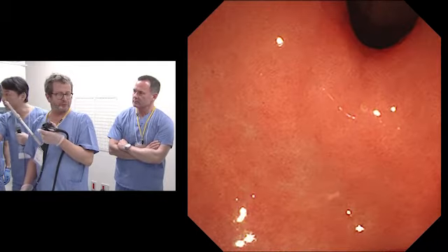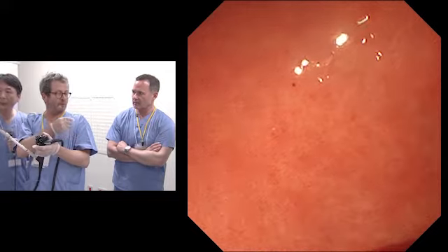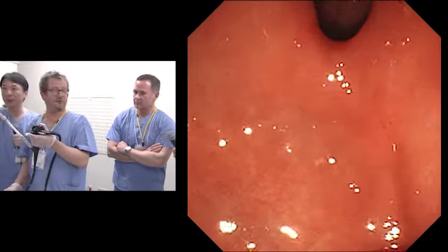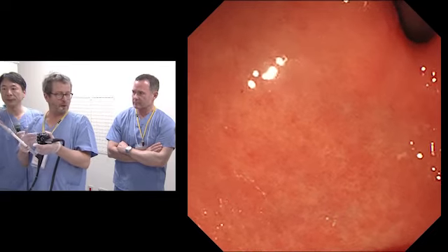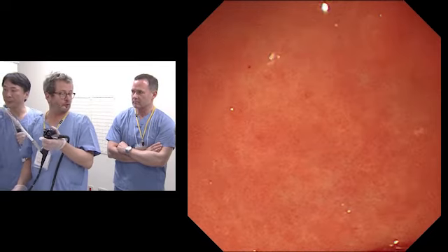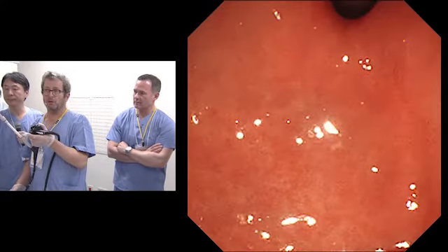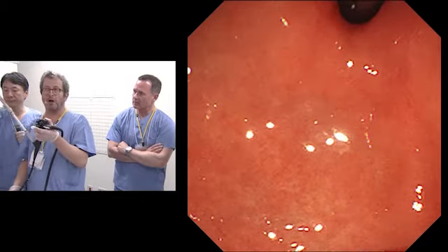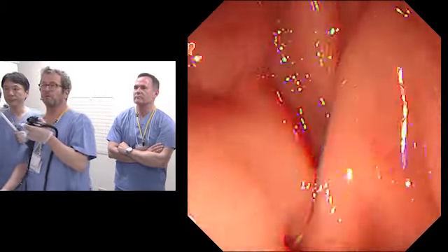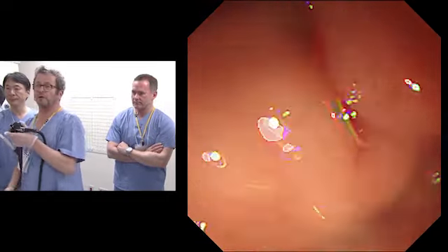The problem with FNB in the past was that it was difficult to manipulate, because the needles were very rigid. But now we have 25 gauge FNB, and the flexibility is more or less the same as a 22 gauge FNA. I'm using both Procore from Cook and Acquire from Boston. So I think definitively now FNB is the gold standard.